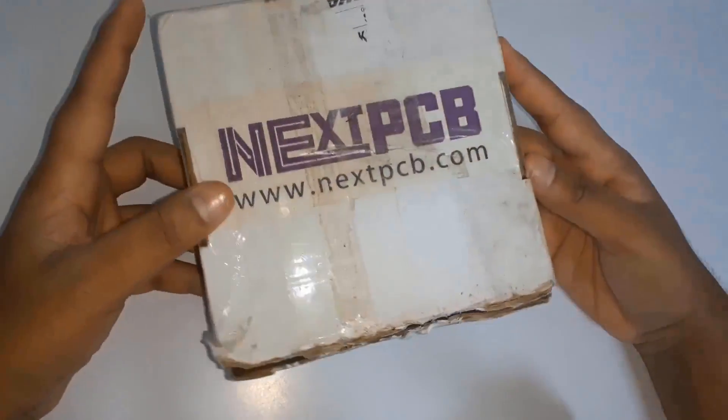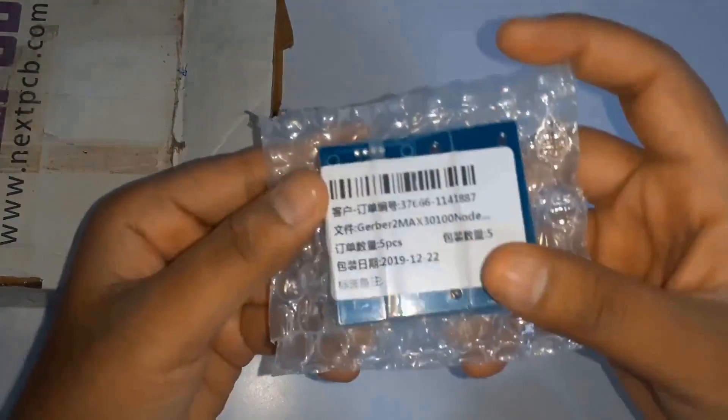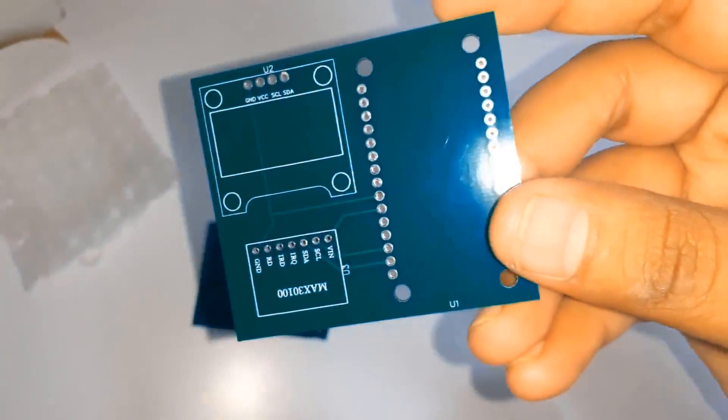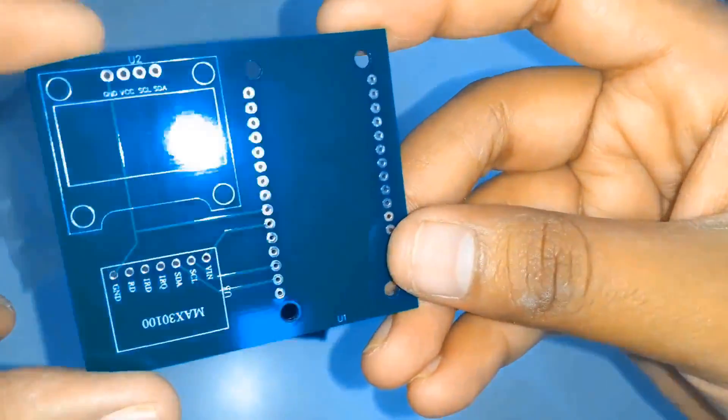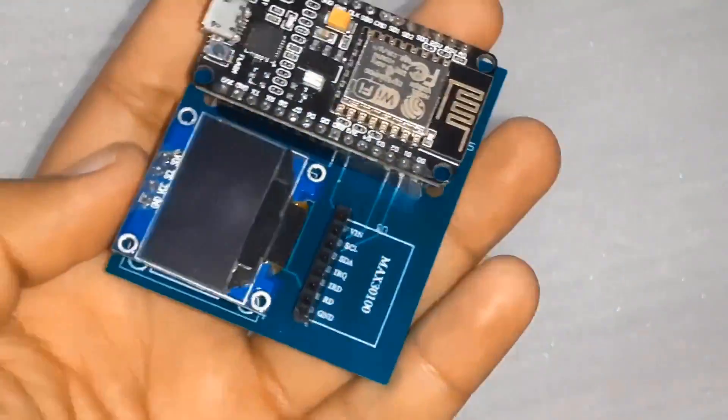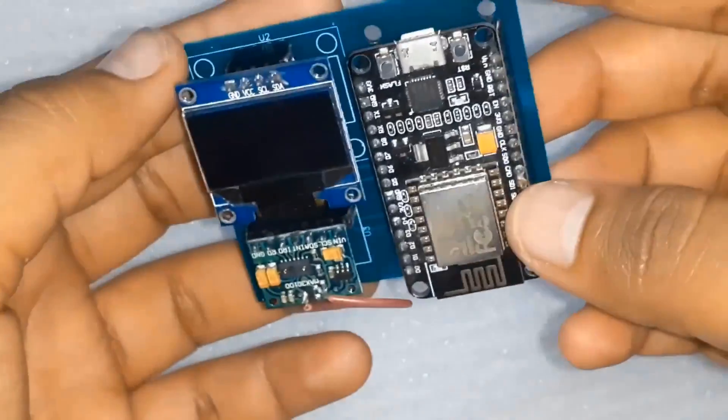After four days I received the PCB from NextPCB. The PCB quality is superb — even better than I expected. I then soldered the female headers and inserted the components into the board, then connected a micro USB cable to power up the entire circuit.